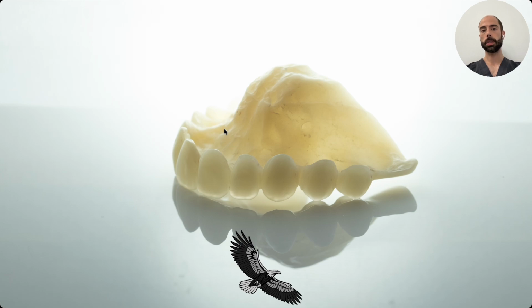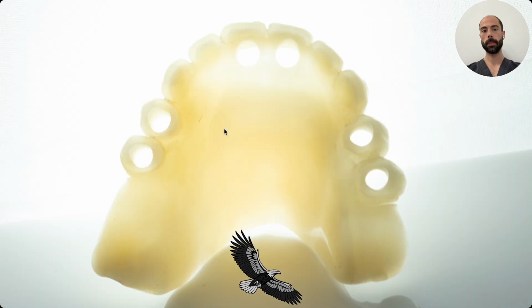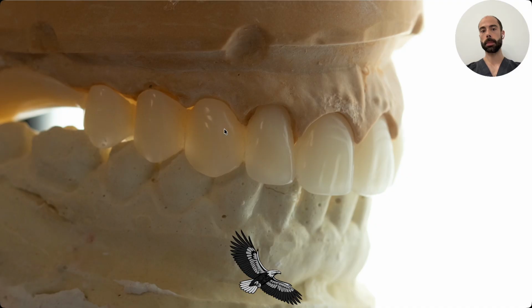Because on the day of the surgery, after we place the CTG where needed, after we know exactly how much volume we've added, where the tissue sits, what each side looks like, we do the pickup intraorally. We connect our provisional to the implants with pickup abutments or multi-unit abutments, inject resin into the open subcritical areas, and we customize each site based on what we see clinically. Everything is ready for the pickup, and here's a point I want to make clearly.